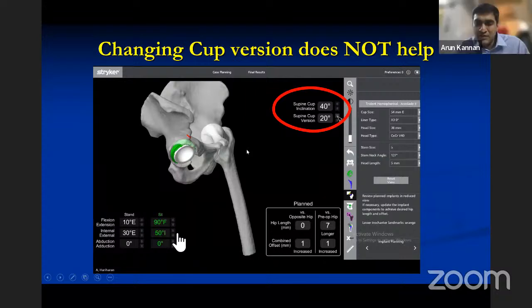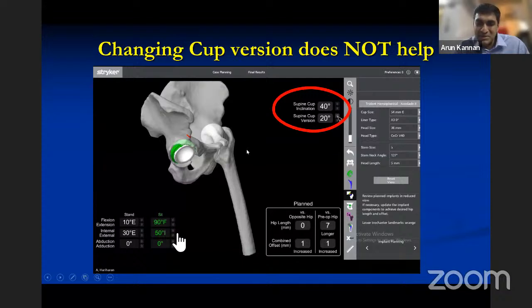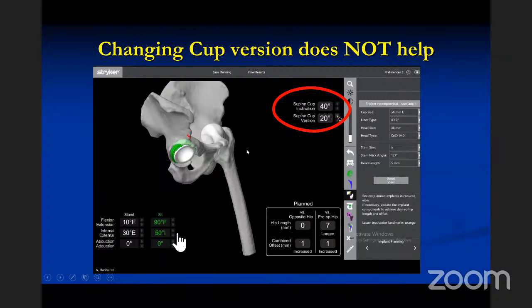For Indian patients, we don't have a published range of motion. Yeah. Even American literature, Australians have some publications, and there are more publications from Japan. So there is some variability, but to back your number to say that 30 degrees is sufficient is very. I'm just asking in curiosity whether your post-operative patients are all doing 50-degree internal rotation and you have any clinical demo of that. You have to check it out. Then only you have to plan for the impingement, how much it comes.